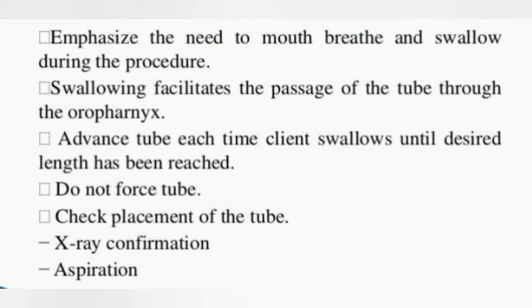We have to emphasize the need to mouth breathe and ask the patient to swallow during the time of the procedure. Swallowing helps the passage of the tube through the oropharynx. Advance the tube each time the client swallows until the required length has been reached. Do not force the tube during insertion.